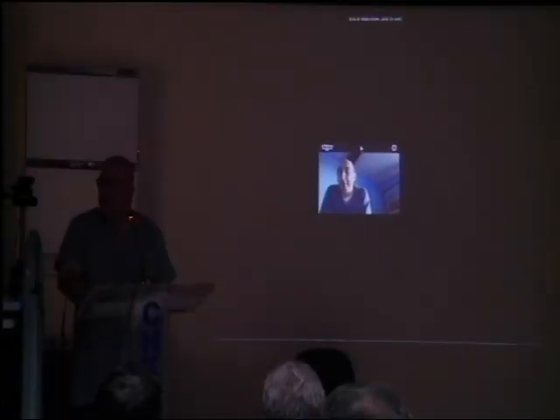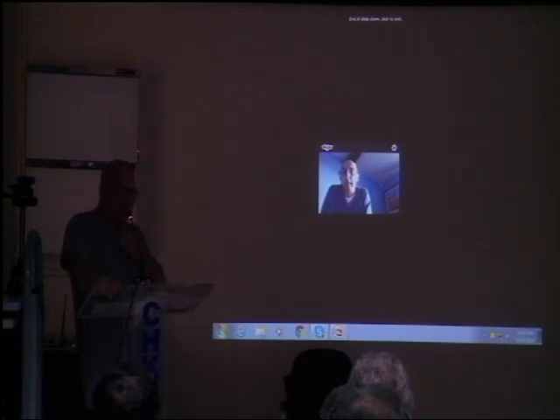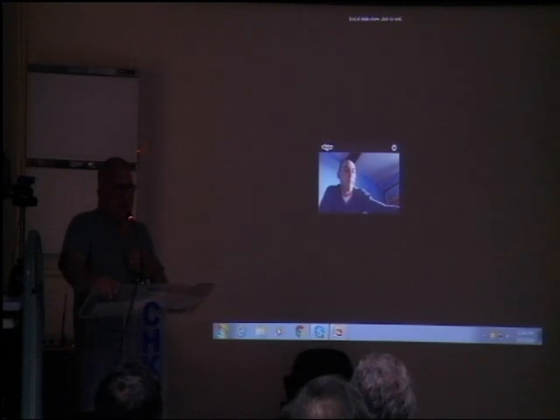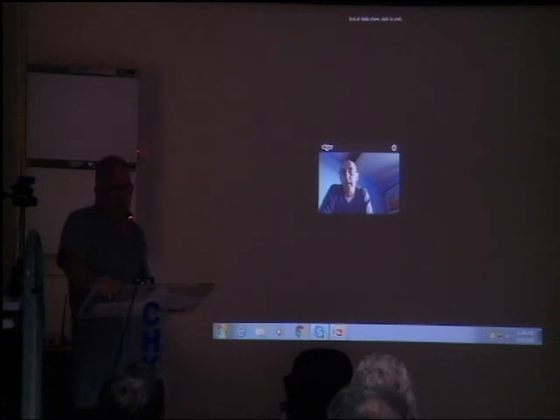Richard, thank you very much. This is the basic skills course. We've got people here who range from not doing very many, a handful, to someone doing 200. The take-home message, I think, is sometimes not to attempt to take off polyps that are beyond you. And the big thing you've highlighted is how to assess it, size it, say where it is, and give an accurate interpretation. And if you're the surgeon involved, and I'm not a surgeon as you know, get the surgeon involved down so they can eyeball it. What would your comments be about that?